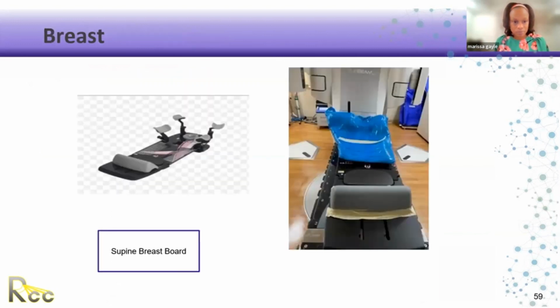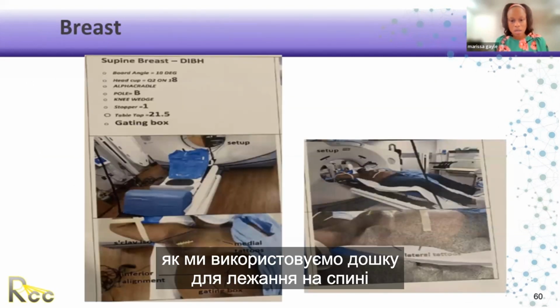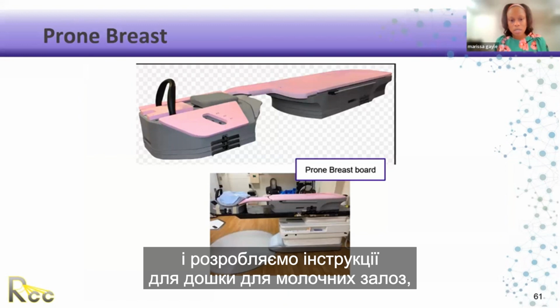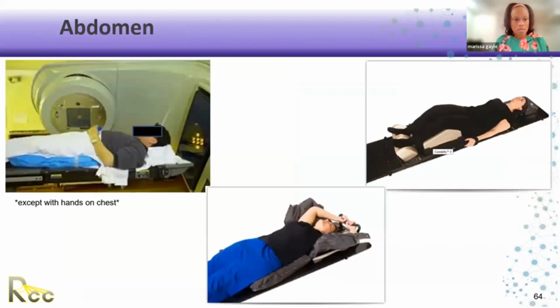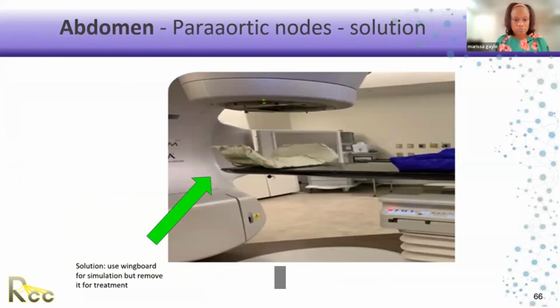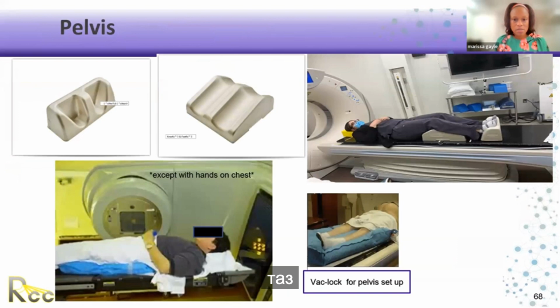Same thing with our breast patients, how we use a supine board, and setup instructions from the breast board, setup instructions for these. And abdomen. Pelvis.